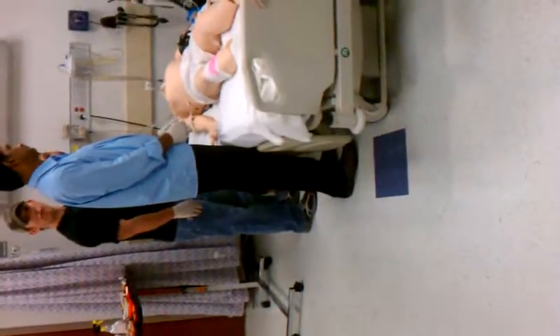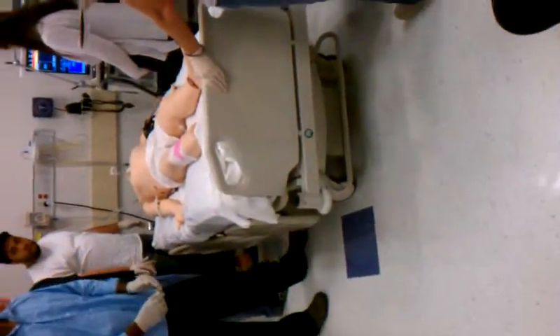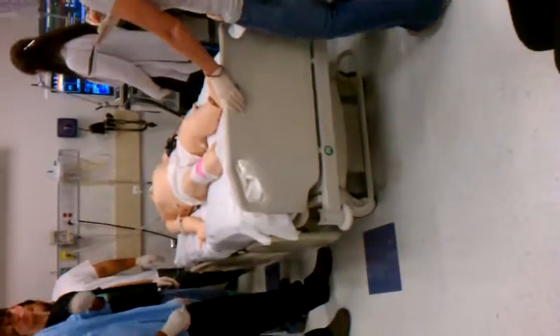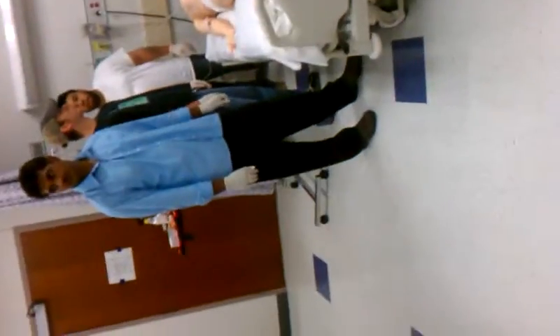So we're getting ready to. So what else do you need? What else would you want to know about? How long has he been on this? Well, we're 3 days in now, so I don't know if he's been on this for a day or 2 days. It doesn't say that, but 3 days later, you're checking him. Rapid shallow breathing: his spontaneous volume is 375 and his spontaneous rate is 16.